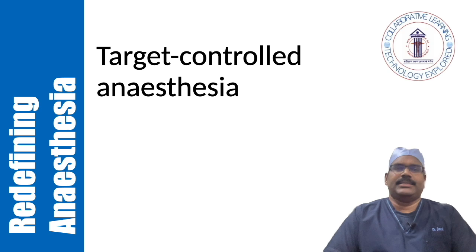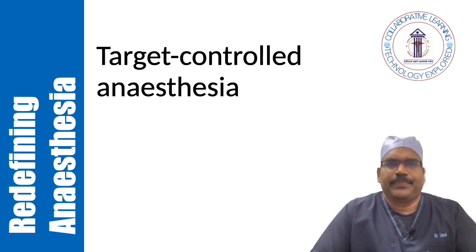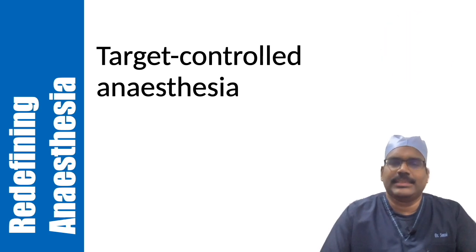Okay, all these advancements are in fact leading to target controlled anesthesia. Where the ET control mode is used, anesthetists set targets for end-tidal oxygen concentration, minimum flow rate and end-tidal volatile anesthetic concentration. The system uses an algorithm to adjust both fresh gas flow and vaporizer to achieve the set values via a negative feedback control system. Fresh gas flow automatically reduces down to the minimum set value, although this can be increased during the case to compensate for system leaks.